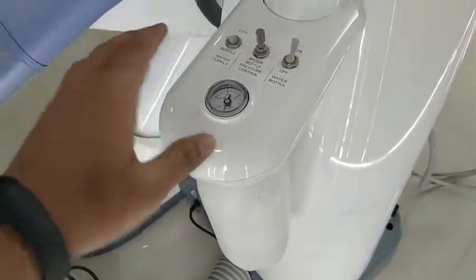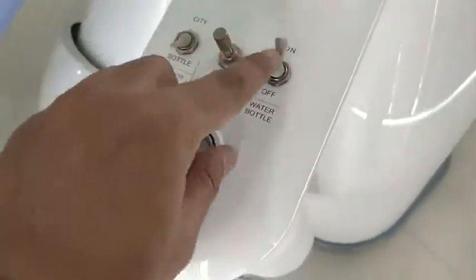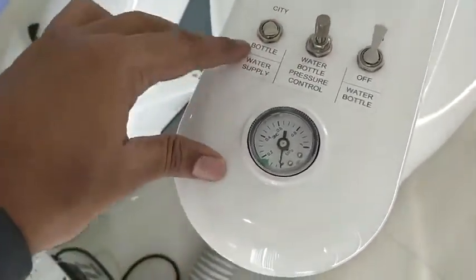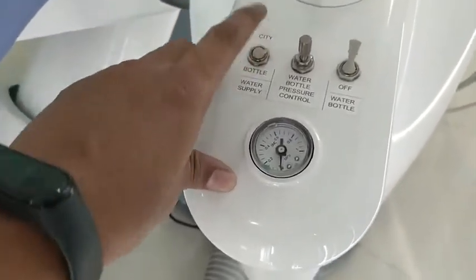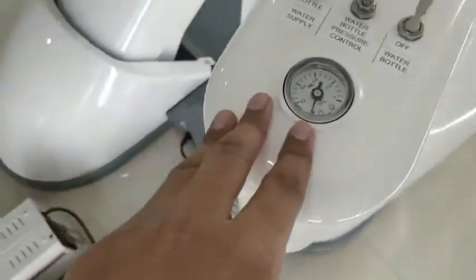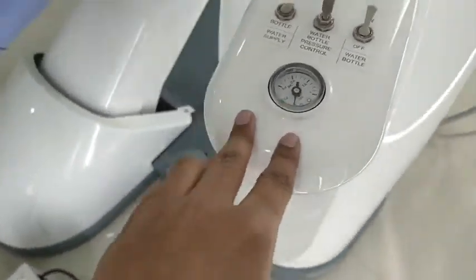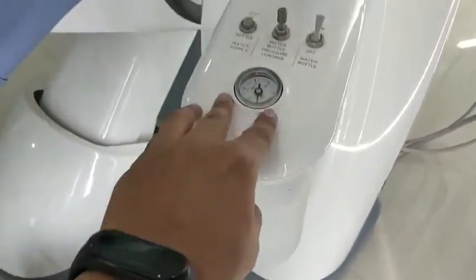Here you can see the booster bottle connections. There is an on/off button for the water bottle, a control for the pressure inside the bottle, and a water supplement selector so you can choose between the bottle or the city line supply. A gauge lets you maintain pressure to avoid over-pressure in the booster bottle.